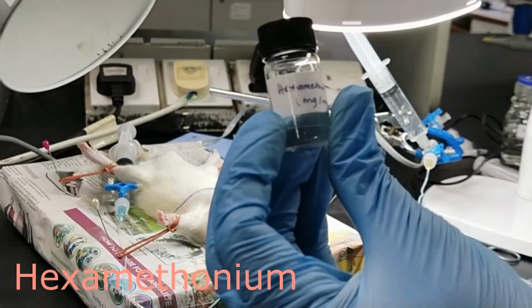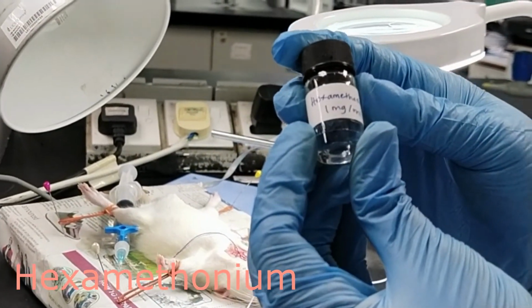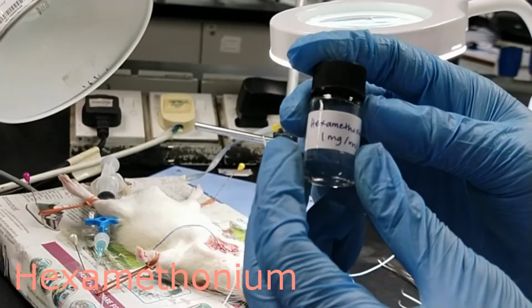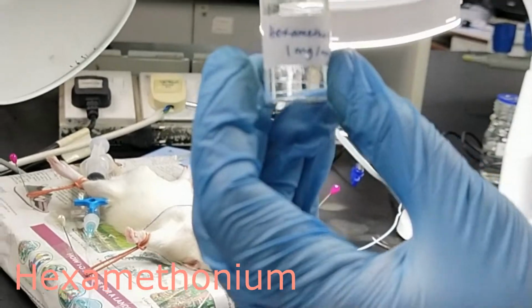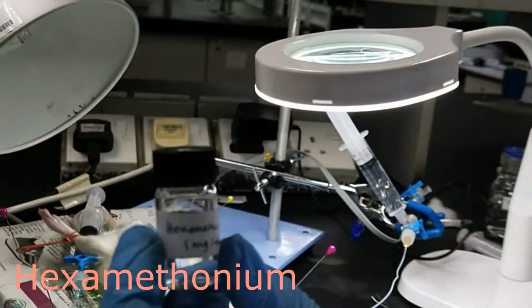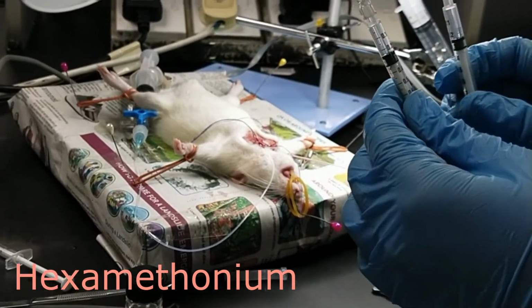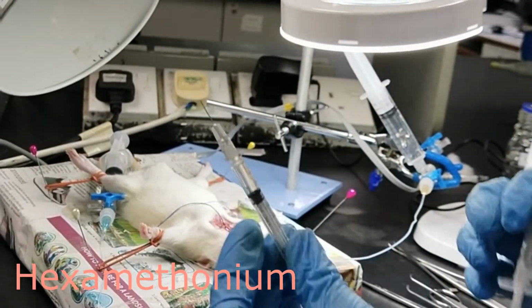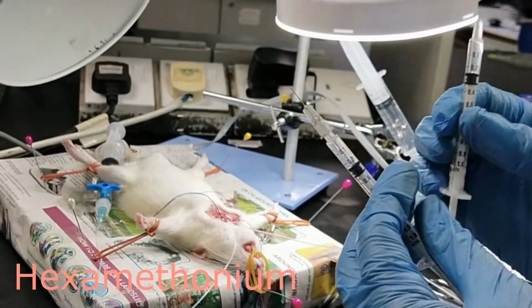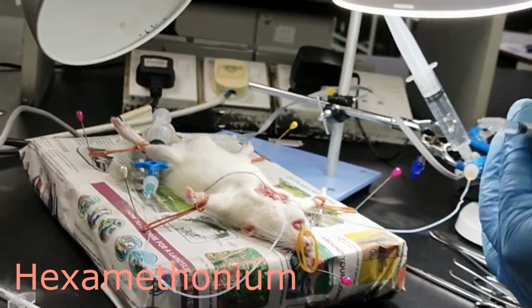Next we're going to proceed with the hexamethonium. The concentration that we use is 1 mg per ml, and the dose for injection is 2.5 mg per kg of hexamethonium. Based on the calculations, we need to do the injection using two types of injections, which is 0.25 ml through the IV and also 0.25 ml through the IP. So we're going to proceed with the intraperitoneal injection.